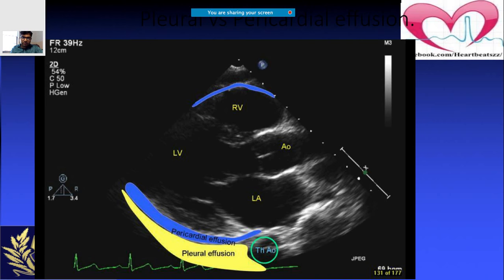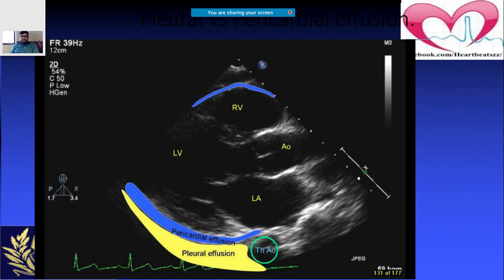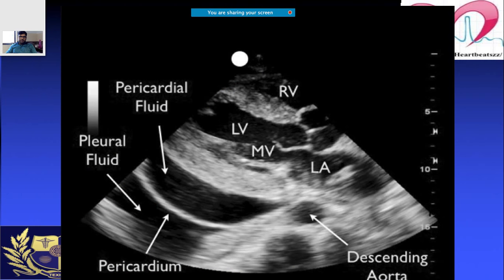A common question is how to differentiate pericardial from pleural effusion on echo. Pericardial effusion is the layer immediately next to the heart, while pleural effusion is slightly further away as it surrounds the lungs. On echo, the layer immediately adjacent to the heart is pericardial fluid, and the next layer beyond is pleural fluid.